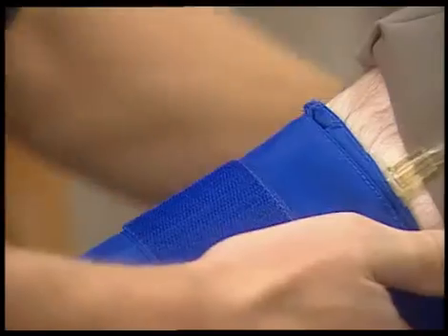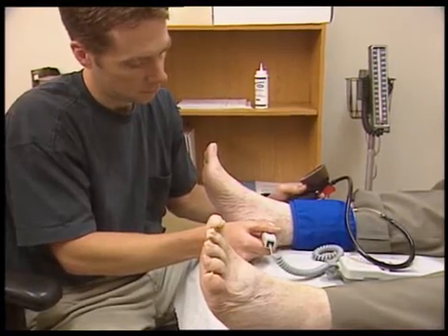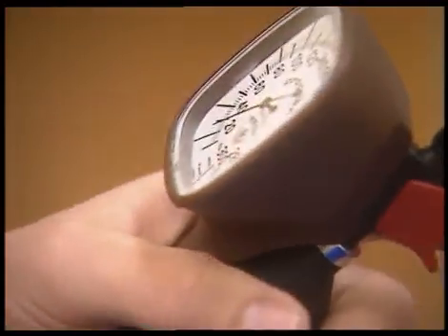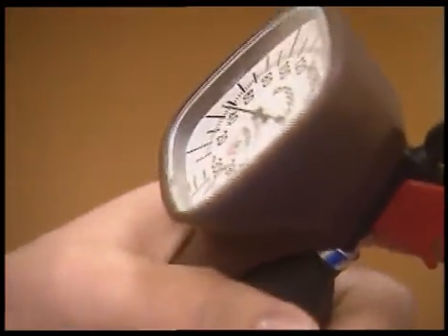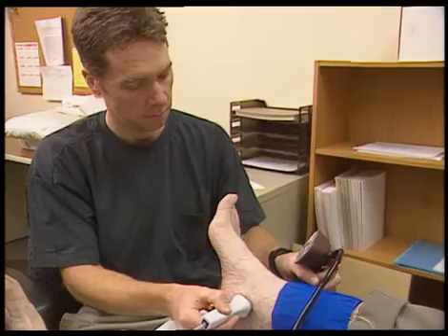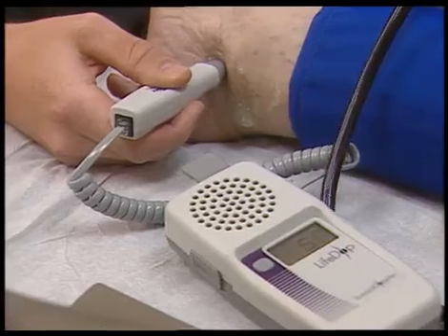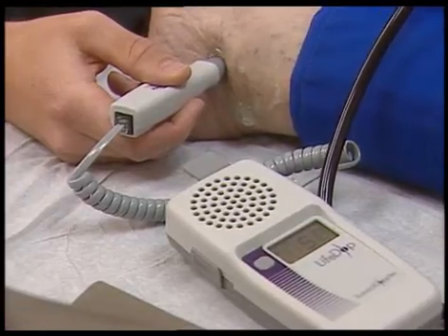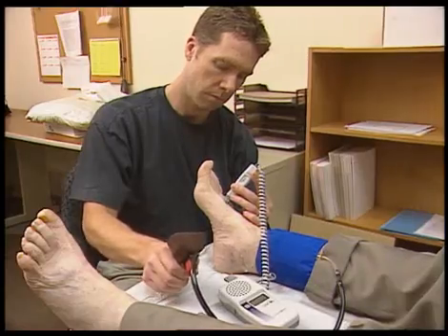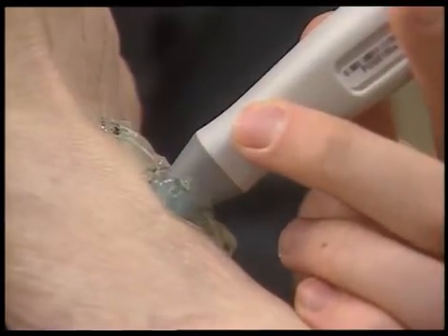The ankle pressures are obtained by wrapping the cuff snugly around the ankle and placing the Doppler probe over the posterior tibial artery on the inside of the ankle. Using the same protocol as you did on the arm, inflate the cuff until the Doppler sounds disappear, then slowly deflate until the sounds are heard again. Record that pressure and deflate to zero. Repeat for the other leg. On some patients, it may be easier or necessary to use the dorsalis pedis artery on top of the foot.